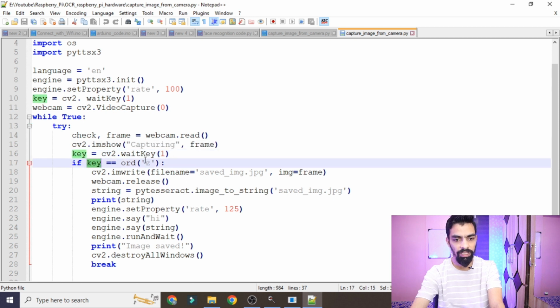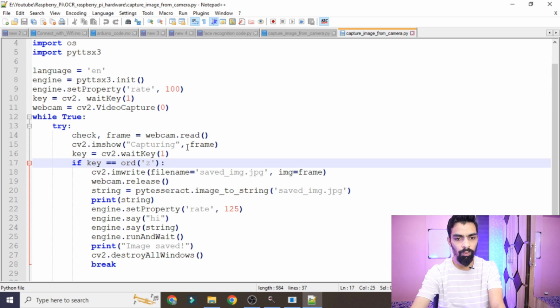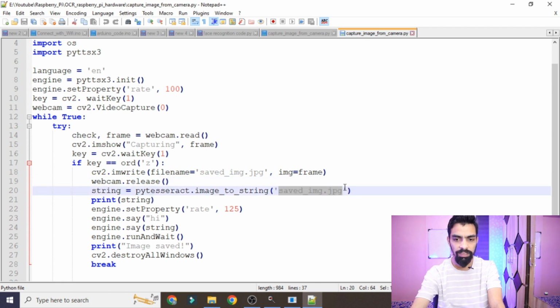This is the line which takes the key from the keyboard. If the key is Z, then whatever image is captured, we store with the name save image.jpg in our folder. To save that image with this name into our folder, this line is used. Then after that we release our webcam, so no need of the camera now. Then whatever image we captured, save.jpg, we have to convert into string form.